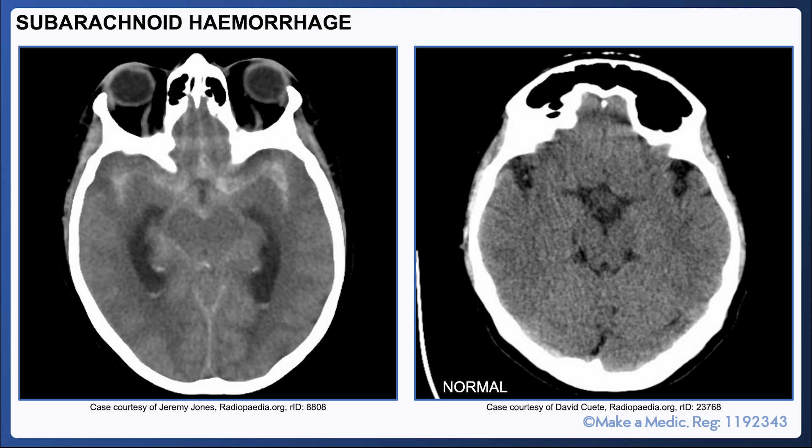If a CT head scan is performed within six hours of the onset of a thunderclap headache in a patient with a subarachnoid hemorrhage, it is highly sensitive. It's characterized by hyperdense material in the subarachnoid space and is usually most apparent around the circle of Willis. Here you can see the hyperdense fresh blood in the subarachnoid space compared to the normal unenhanced CT scan on the right.